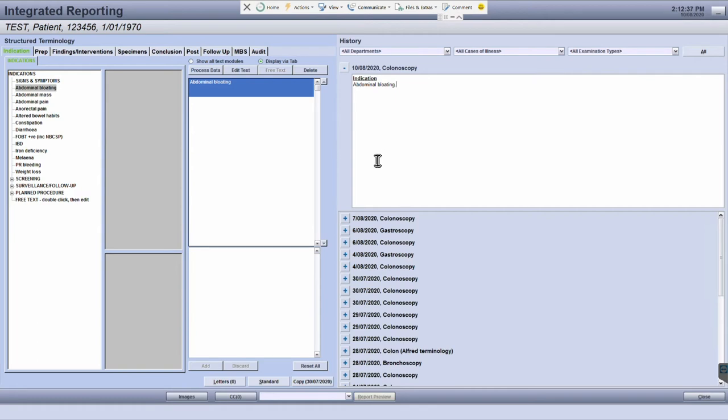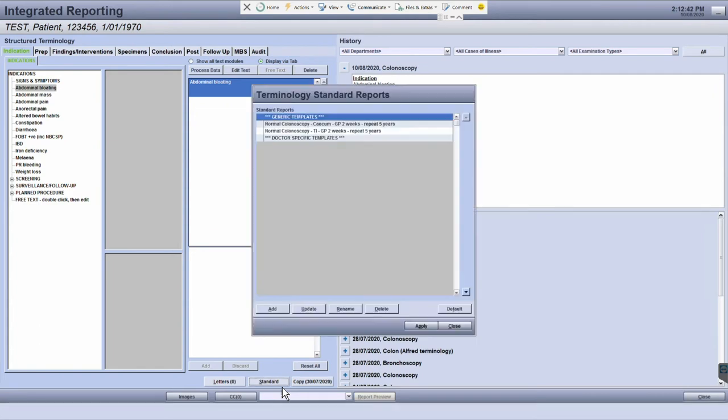To view the current standard report templates, click the standard button at the bottom. Here you'll be able to see the available standard report templates.